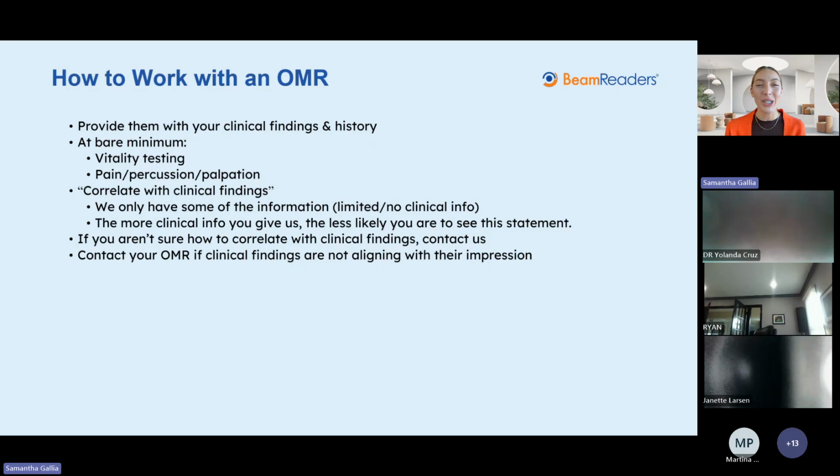Okay. But we get so many providers who don't provide any clinical findings and history. So at a bare minimum, if you can let us know the vitality testing, pain, percussion, palpation. Correlation with clinical findings is something that we say a lot, and we say that because we only have the information that you give us when you give us the intake for that scan. So the more clinical information you give us, the less likely you are to see that statement from us, because we'll be able to correlate it with the information that you provided.